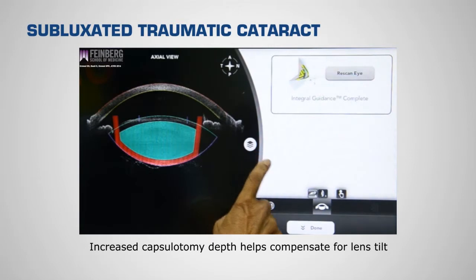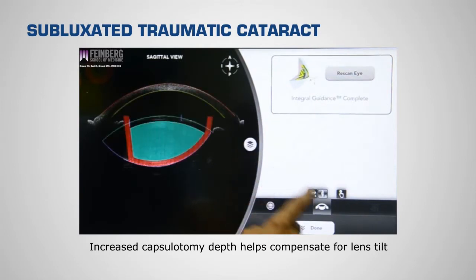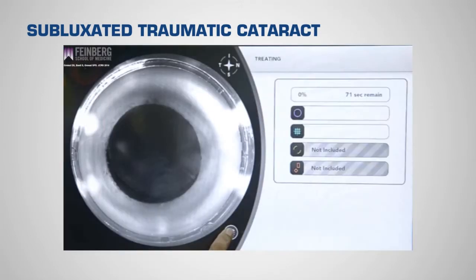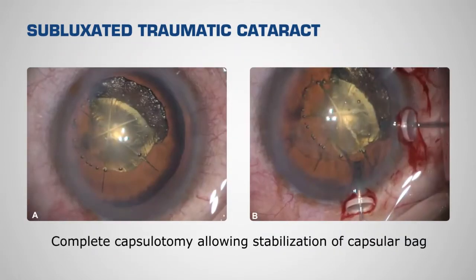Lens fragmentation into sextants was performed without softening to minimize the amount of intralenticular cavitation gas, which could increase the amount of subluxation. The femtosecond laser allowed us to perform a complete capsulotomy and fragment the lens in a closed chamber prior to creating corneal incisions, thus minimizing zonular stress.